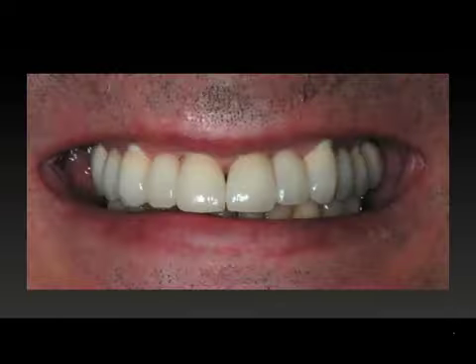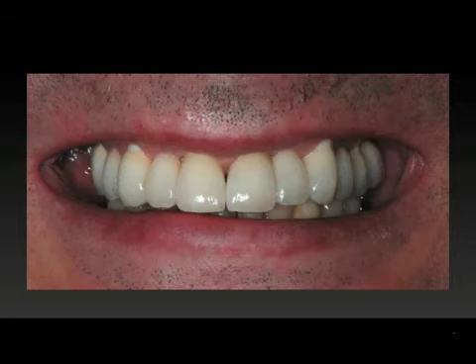This is what it can look like. The exposed implant surface, or the white margins, could have easily been prepped and could easily have integrated a more, quote-unquote, aesthetic prosthesis, but this patient really didn't care. They came in with teeth that looked like the previous slide, and periodontally, we know that there is no better stability than keeping these margins in a more cleansable area.